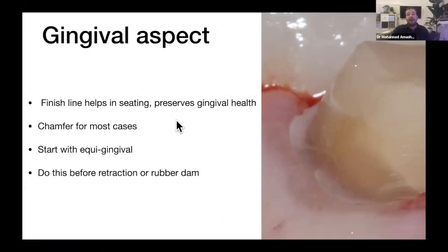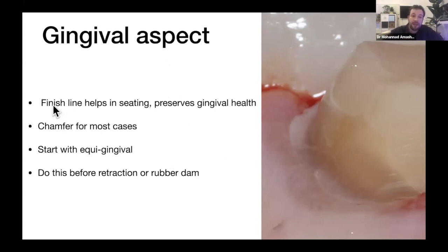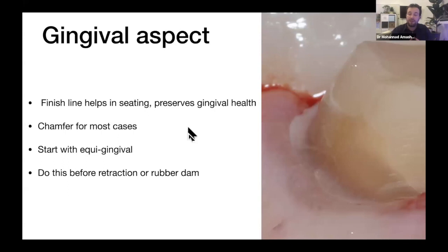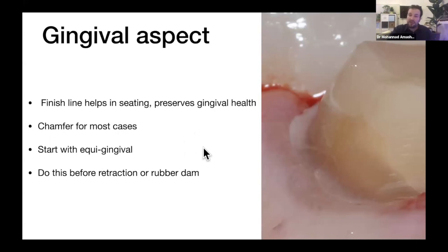Now for the most important part of the preparation: the gingival aspect. First, why do we need a finish line? A finish line is important for gingival health, for veneer seating — similar to the butt joint at the incisal aspect — and it helps the lab technician know where to stop the veneer. Without a finish line, it's difficult to seat the veneers and know their position. A finish line also ensures correctly contoured restorations that won't damage the gingiva. I use a chamfer for most cases, and I start with equi-gingival preparation.